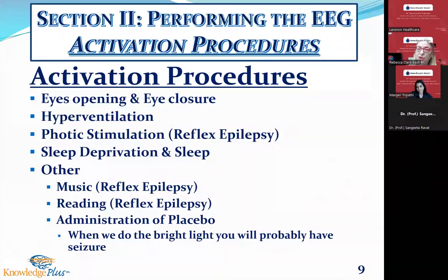Using EEG, we were able to identify not one, but several episodes. And then later determined there was no electrographic signature of epilepsy. There were no spikes during that period. So Patricia did not have to go on yet another drug.